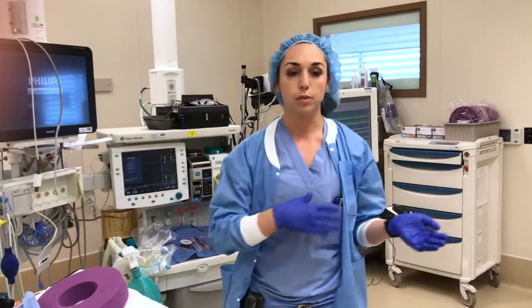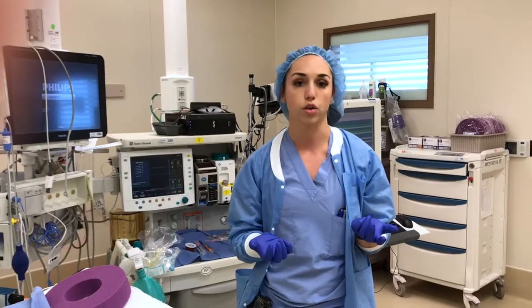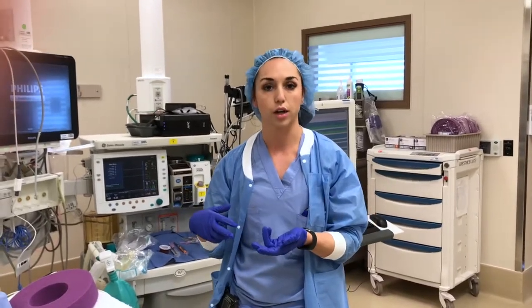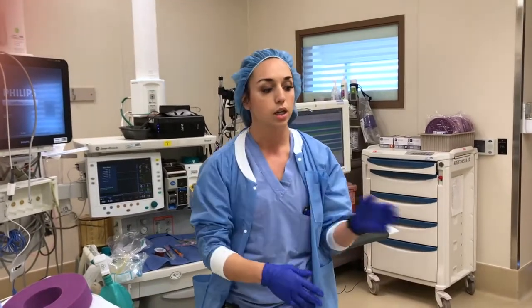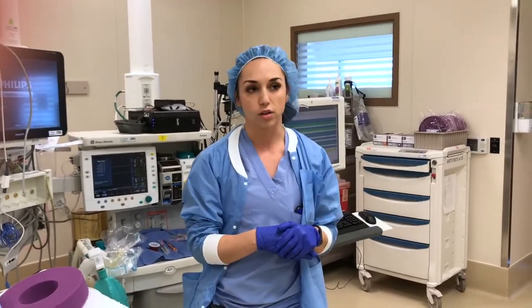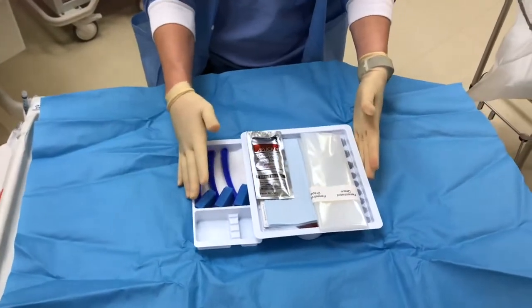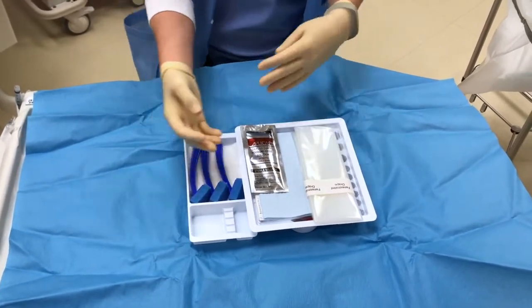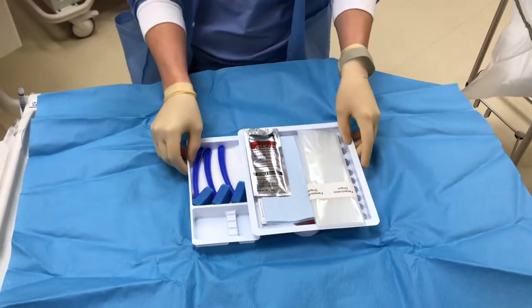For the tubals, most of the patients will walk in and will immediately sit on the bed. There's no need for fetal monitoring. So as soon as you put your basic monitors on, with the exception of the EKG leads, then you're free to proceed to your spinal kit to start setting up. A lot of times, since you don't have the 5-minute fetal monitoring, you may be performing the spinal kind of as you go versus having it all set up like the C-section.